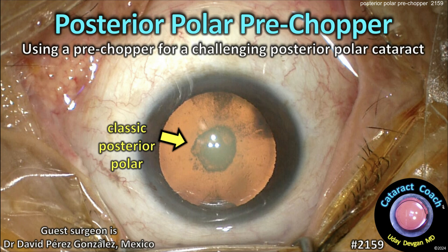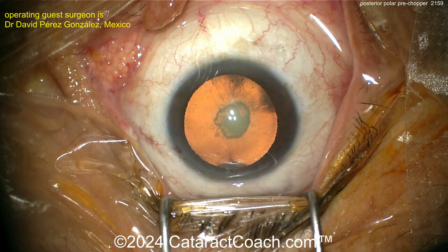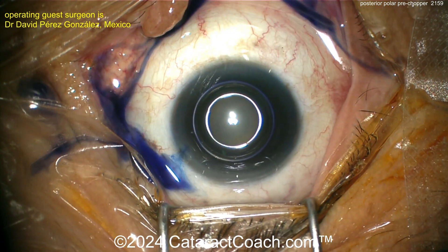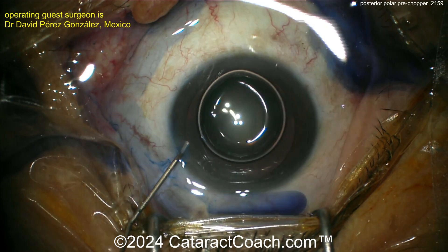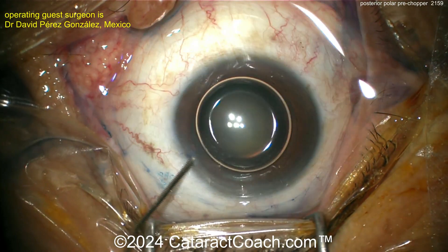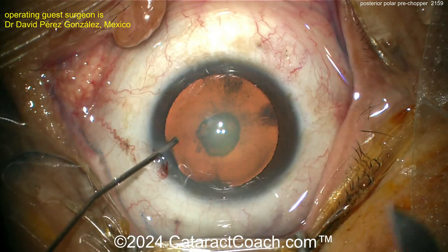From cataractcoach.com — posterior polar cataract managed with a pre-chopper. You can see there's a very classic-looking posterior polar cataract with a well-defined posterior opacity that is going to be a challenge. Trypan blue dye is going inside. It's important to get a good capsulorhexis because in these cases the posterior capsule can be weak, fragile, or even frankly absent in that focal area.